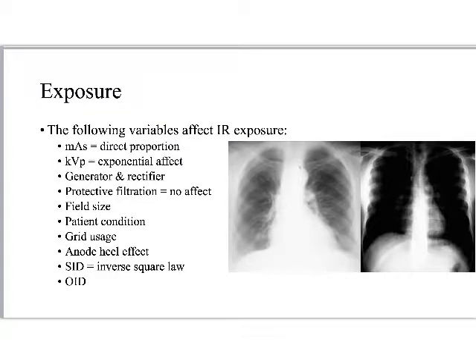So, exposure. We've defined exposure really carefully now. In fact, the last lab that we did, so everyone's done the half value layer lab at this point, right? And we all should have some idea in the back of our minds what we're talking about when we talk about exposure, right? Generally people mention this as the quantity of ionization that's occurring. The amount is the exposure.